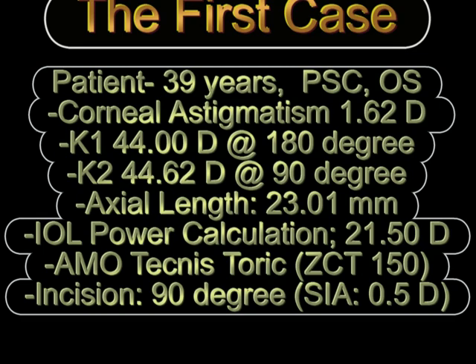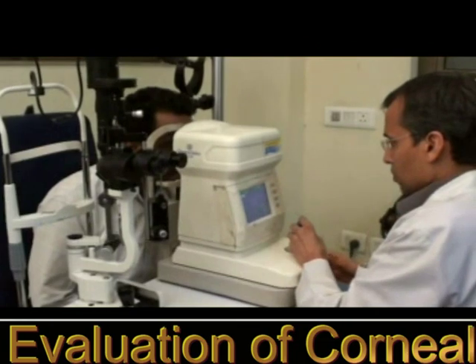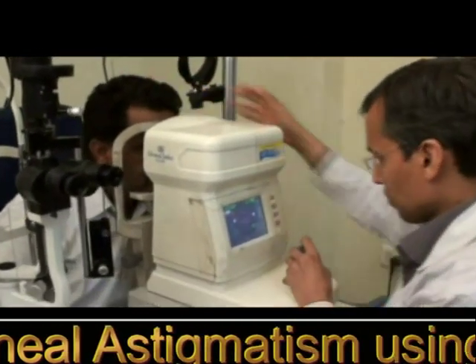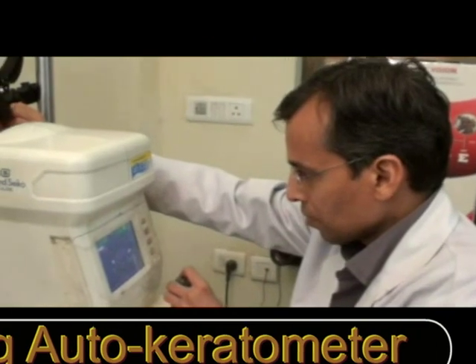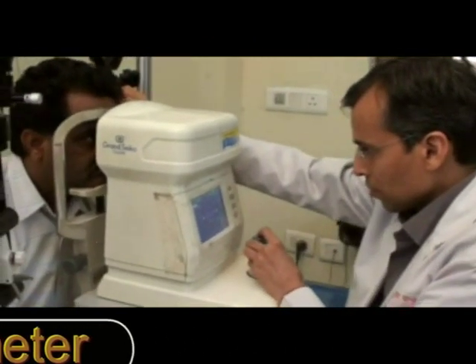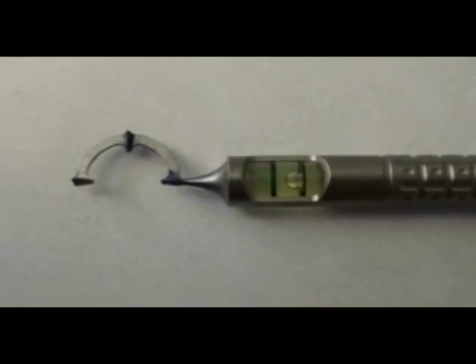The first step is of course to do the marking for the toric IOL. The pre-operative workup has to be extremely careful. Even though manual keratometry remains the gold standard for measuring corneal astigmatism, in a busy OPD the auto refractor with an auto keratometer gives quite reliable results, and this combined with topography can be used to get a good idea about the corneal cylinder.